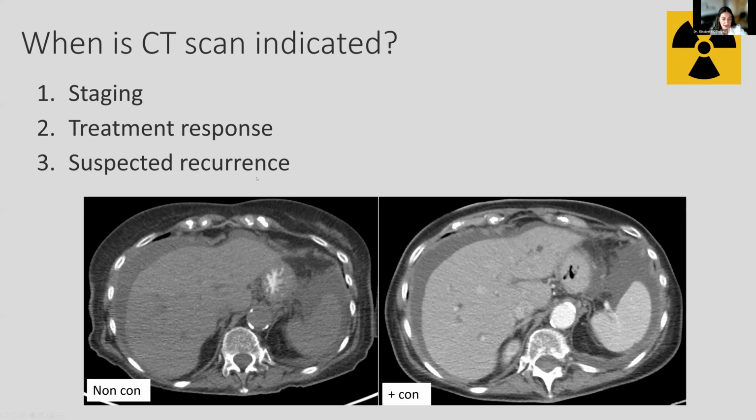So it's unlike ultrasound and MRI, which I spoke about earlier. CT is slightly different. It does have radiation, so there is a radiation exposure with this test. But it's a pretty quick test. It's very useful. It gives us a lot of information. We typically in ovarian cancer patients do a CT chest, abdomen, and pelvis. And CT chest is superior to any other modality, ultrasound or MRI, for evaluation of chest and lung findings. So it's helpful in that situation.